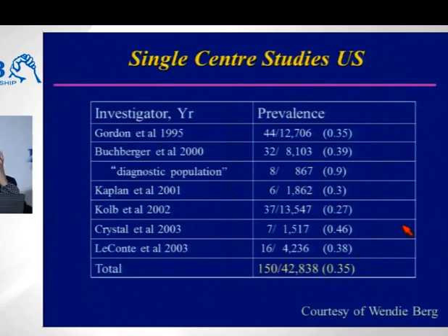Now, we reported our data on screening, and ours was a retrospective study of just scanning the ipsilateral breast in the mid-90s, but soon after, multiple other single investigator publications came out with, look at that, a fairly similar pickup rate for cancer. So these were cancers that were not palpable, and they weren't visible even in retrospect on the mammogram.